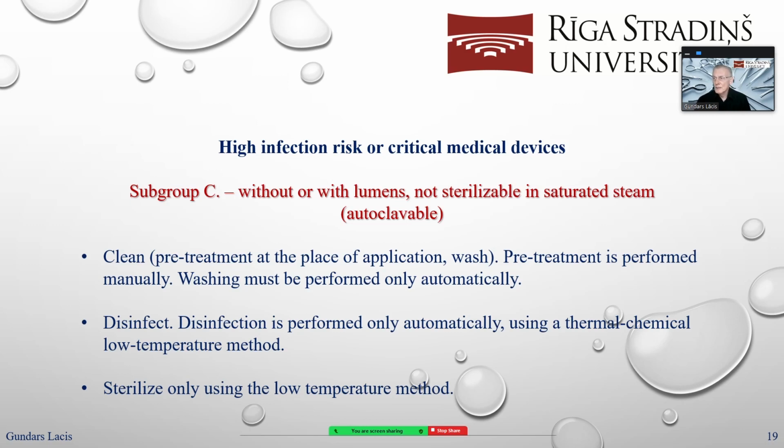That is why it's high risk, because in both those steps, disinfection and sterilization, instead of saturated water steam, we are using chemical active agents. And yes, chemical active agents are not as safe as thermal disinfection or sterilization using saturated water steam.